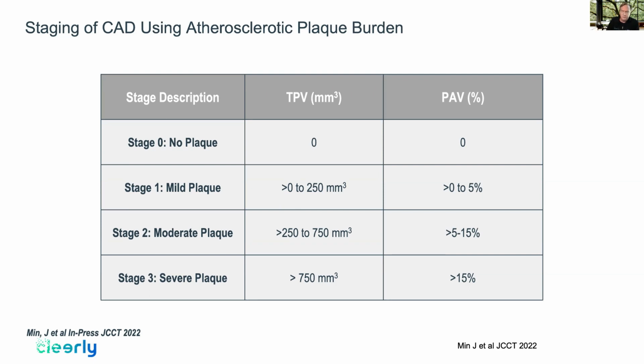In the probably 5,000 or 8,000 patients I've now seen using our software, we see up to about 30, maybe 35% atheroma volume in the very sickest patients. So that would be an extreme example. Most of it, of course, is well below 15%.